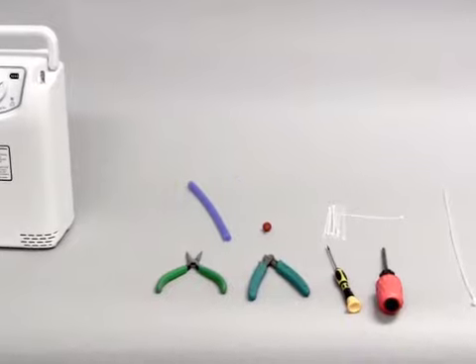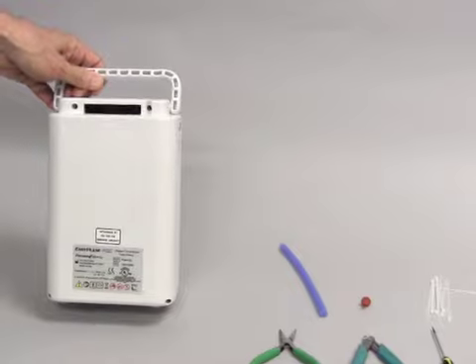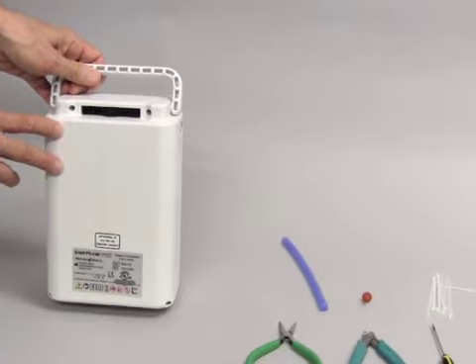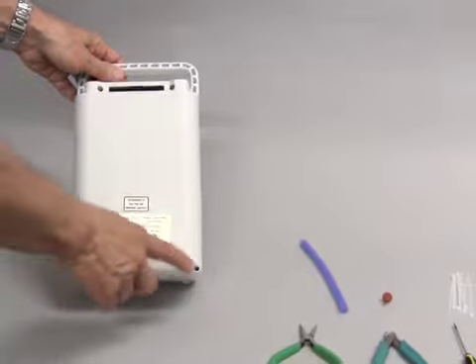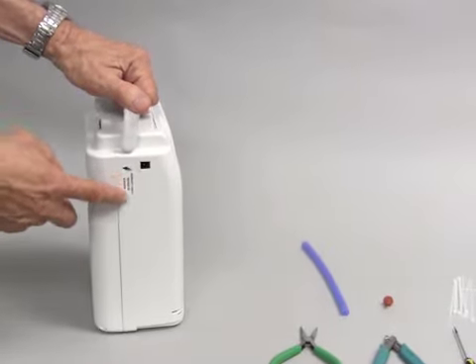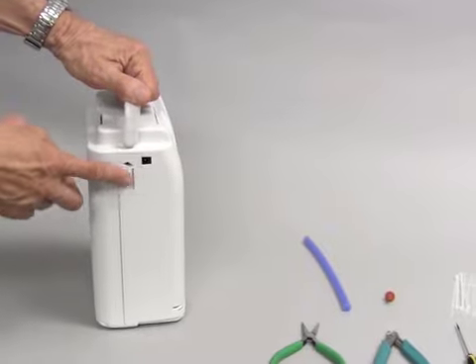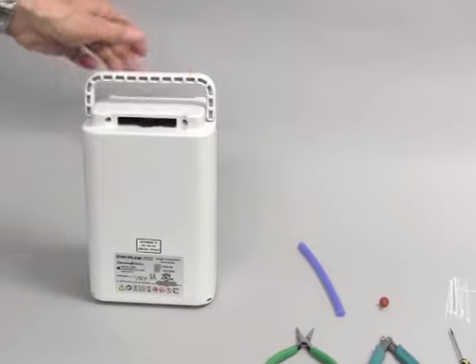Okay. All right, the first step you need to do for taking apart the POC is to remove the 4 screws from the back of the device. You also will have to remove the security label, which will not be replaced when we reassemble this device.